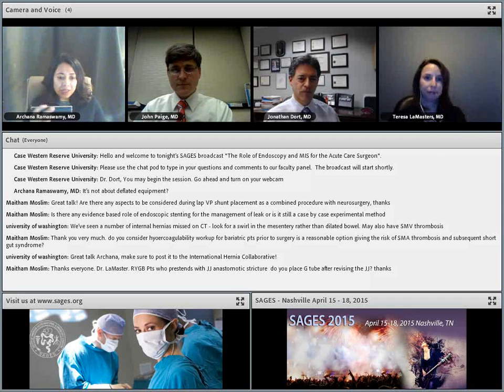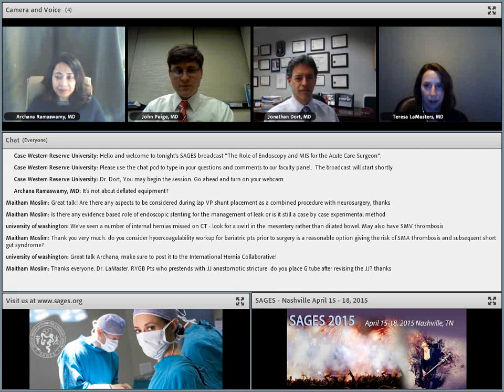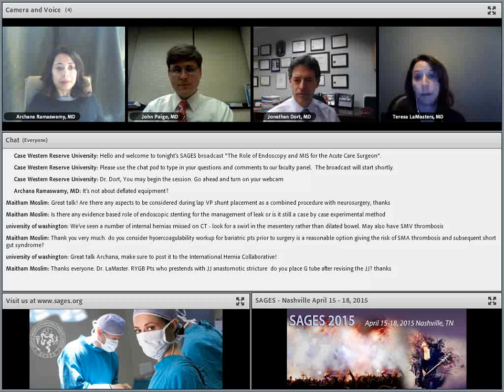So Terry, I think there's a question that was typed up. With Roux-en-Y gastric bypass patients with JJ strictures, do you place a G-tube after revising the JJ? I am an advocate of gastrostomy tubes with revisions. I think they can protect you in a lot of ways. Even though they are invasive and the patient has them for several weeks, they can really be a helpful tool.